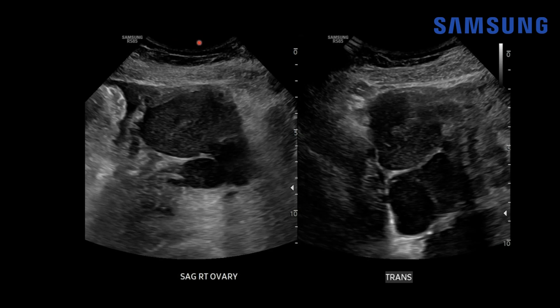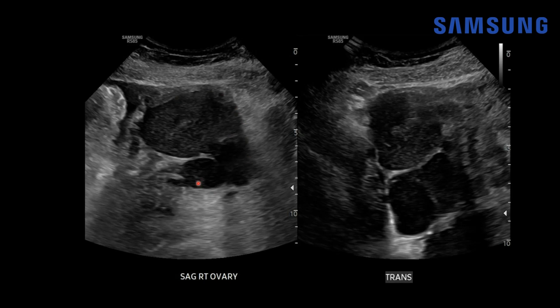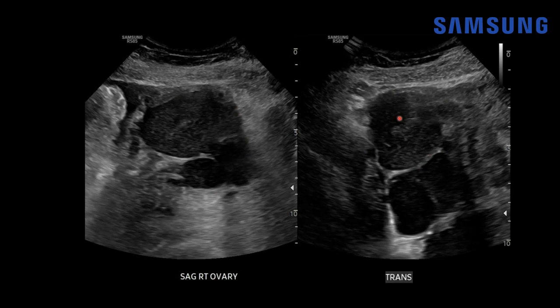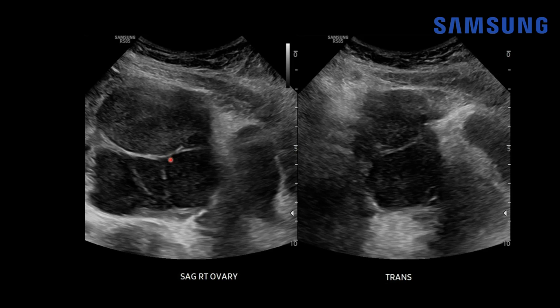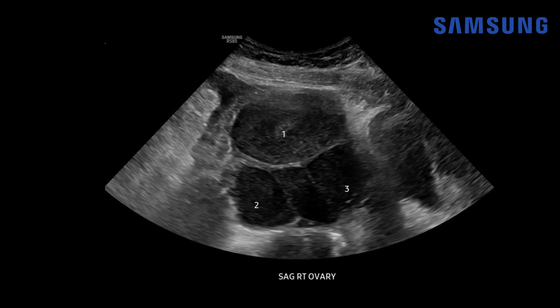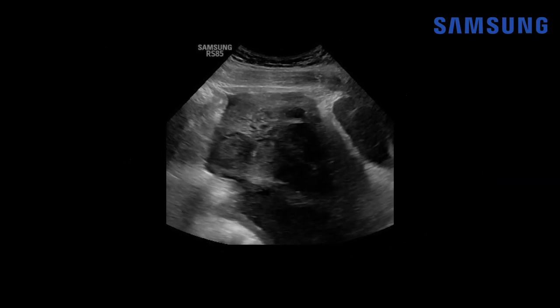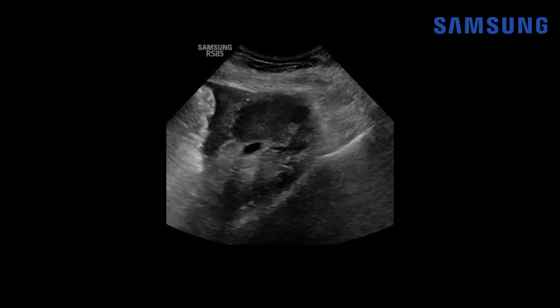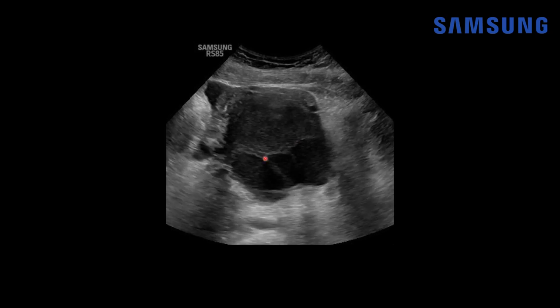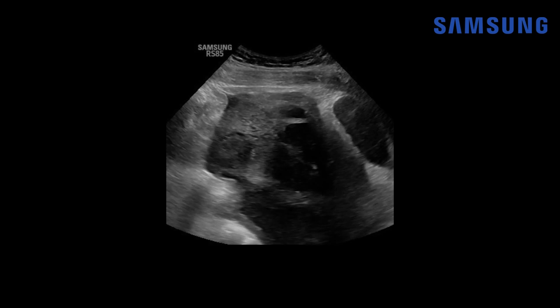Let's move on to the final case, case number three. Here we have a transabdominal image showing the right ovary, which is replaced by a large multilocular cystic mass containing septations and low-level internal echoes. We see multiple locules on sagittal and transverse imaging — the sonographer thoughtfully numbered the individual locules. The cine clip nicely shows the multilocular configuration of this endometrioma with thin and thicker septations. We also see some posterior acoustic enhancement, which can be a feature of endometrioma.